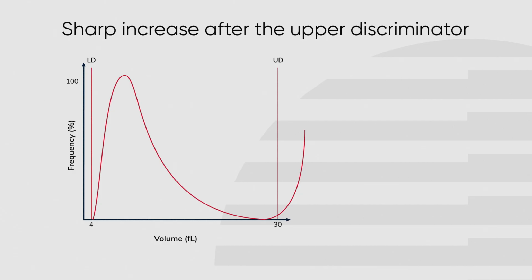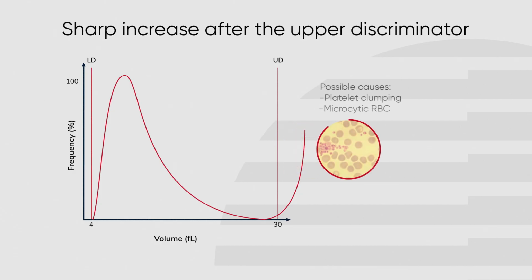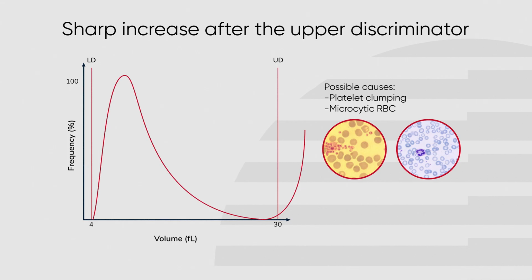If the platelet histogram shows a sharp increase after the upper discriminator, this can indicate platelet clumping or the presence of microcytic RBC. Check for platelet aggregates in smear.